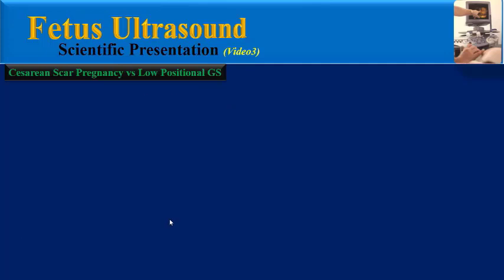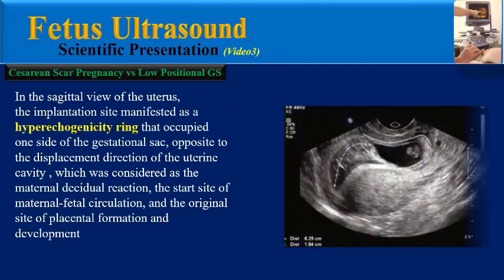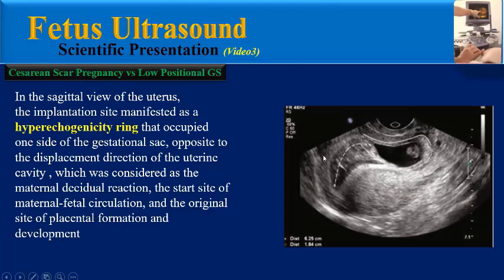In the sagittal view of the uterus, the implantation site manifests as a hyperechogenicity ring that occupies one side of the gestational sac opposite to the displacement direction of the uterine cavity, which is considered the maternal decidual reaction, the start site of maternal-fetal circulation, and the original site of placental formation and development.